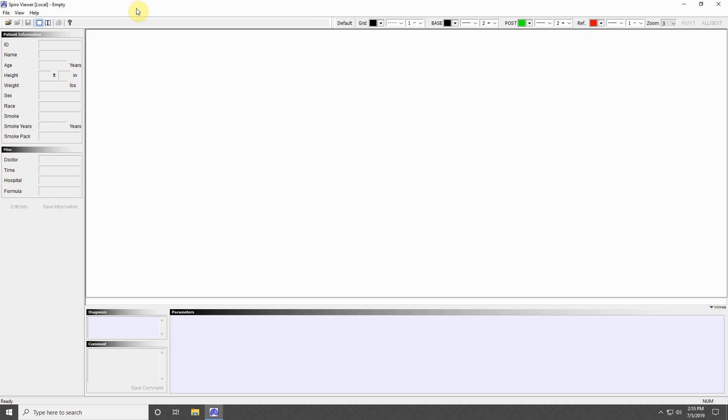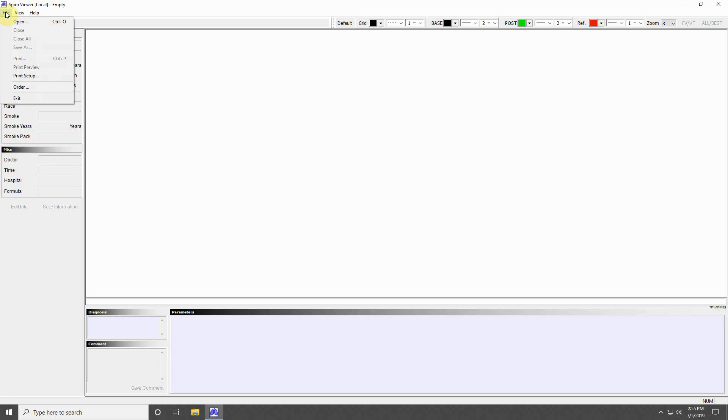In the top left corner, you will find the program drop-down menus. File will allow you to open, close, save, and print your spirometer file.